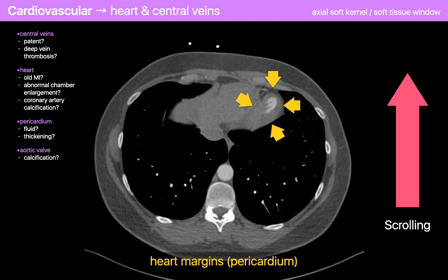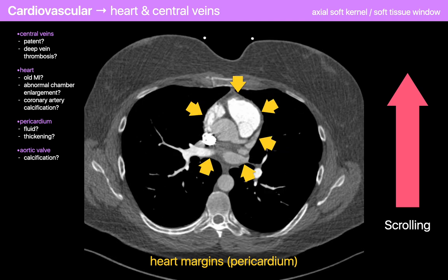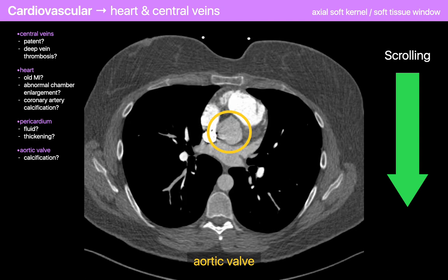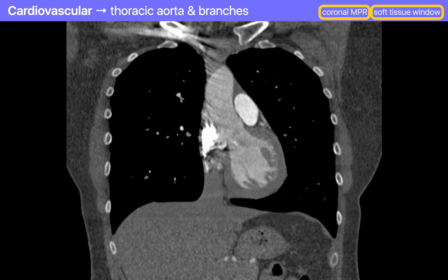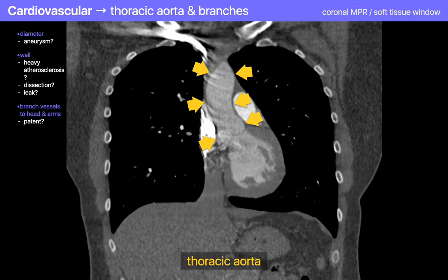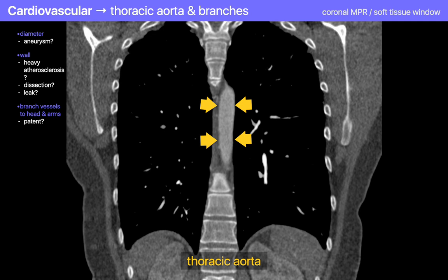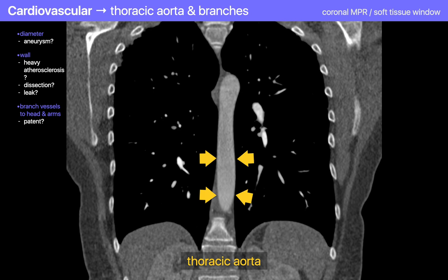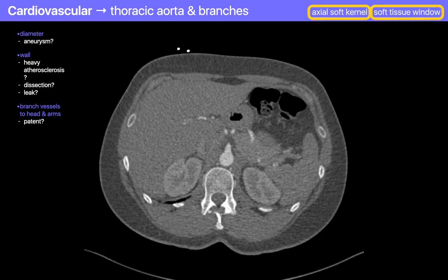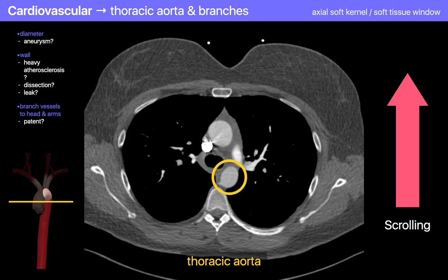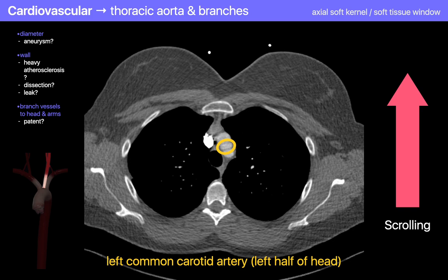I then do my inspection of the pericardium, looking for fluid, soft tissue thickening, and calcification. Then I take a look at the aortic root for aortic valve calcification. The next part of my search is the thoracic aorta and its branches — usually starting on the coronal views, looking at its course, diameter, degree of atherosclerotic calcification, plaque, and any intramural thrombus. The coronal MPRs are where I may drop caliper markings to estimate the aortic diameter. I then go back to the soft kernel images on a soft tissue window to take another look at the thoracic aorta and also peek at the large vessels branching from the aortic arch.